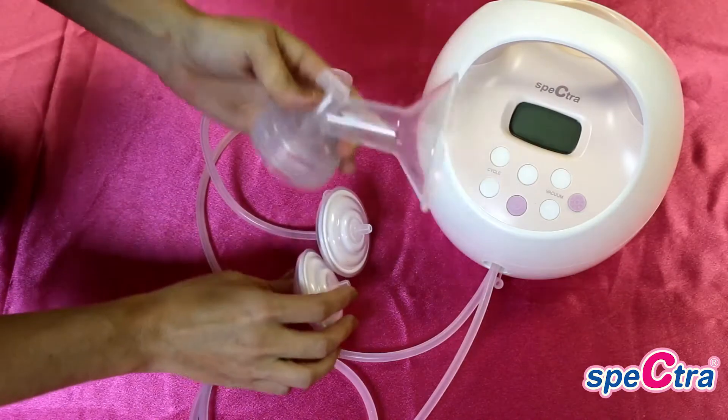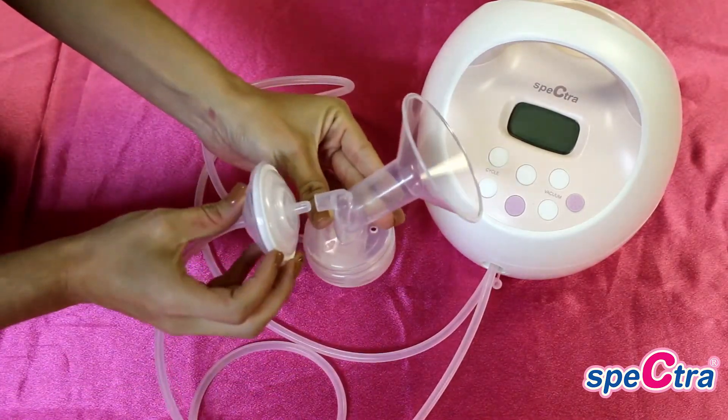You will then attach your flange to the backflow protector's larger connector.